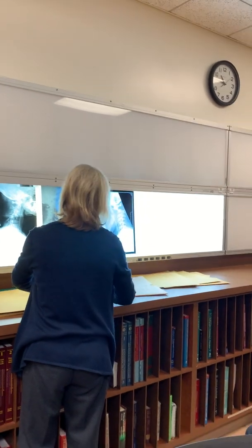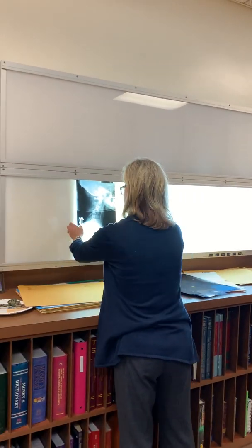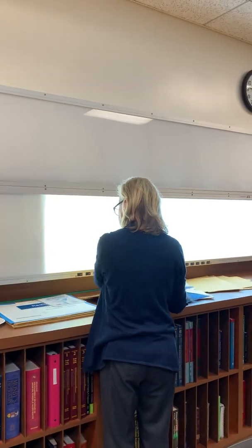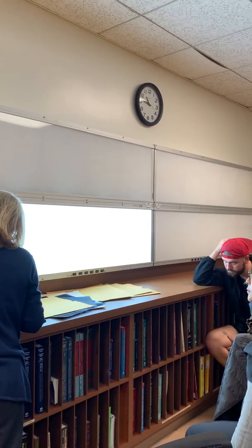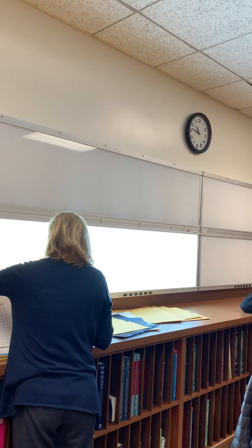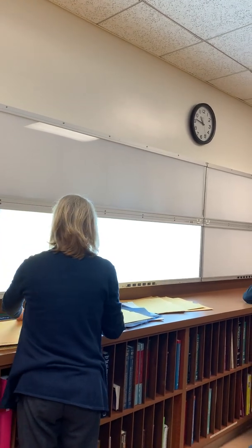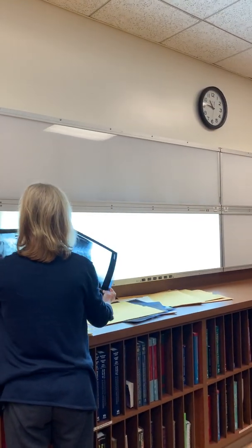Oh, that's the same one. Is it quick today? No, it's Thursday. This is an interesting one.